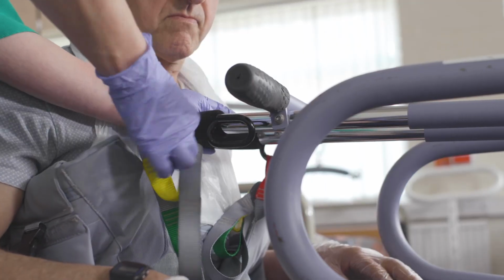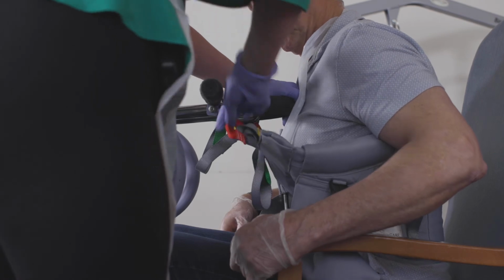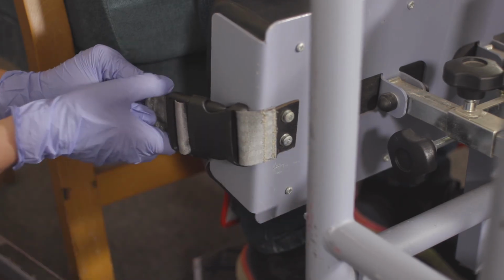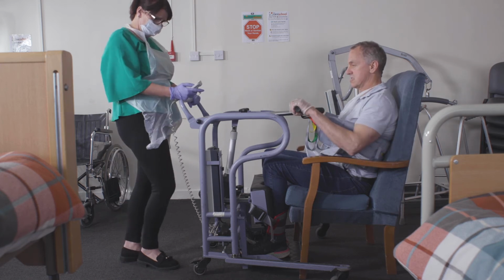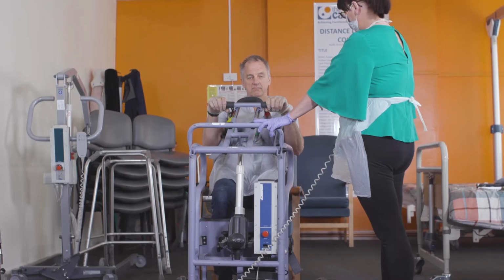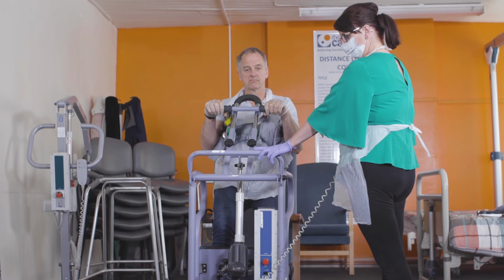Connect the short hoops to the hook on the standing aid. So then attach the leg strap and then go around the other side and clip it in and adjust. Ask the service user to hold on to the handles. I will then use the remote control to raise the service user into a standing position.